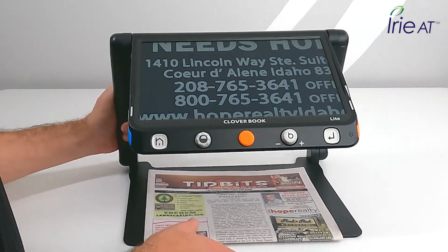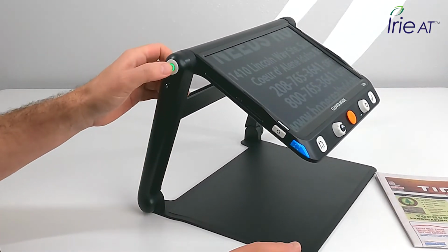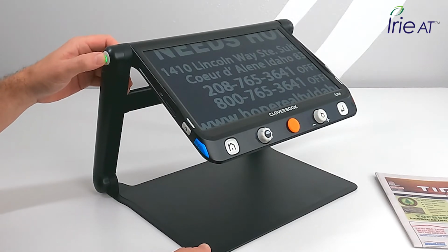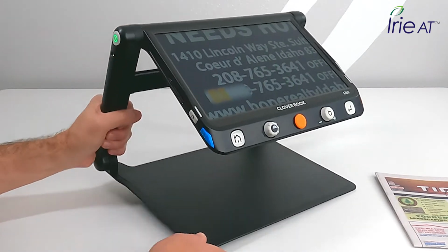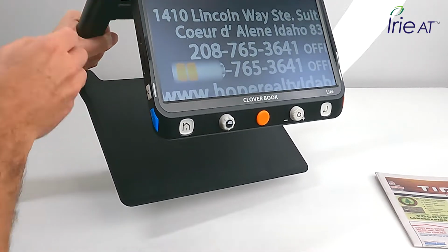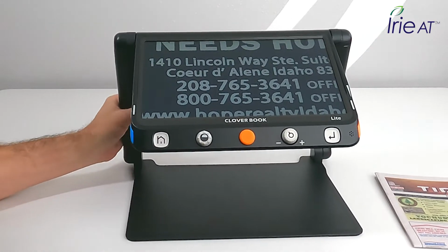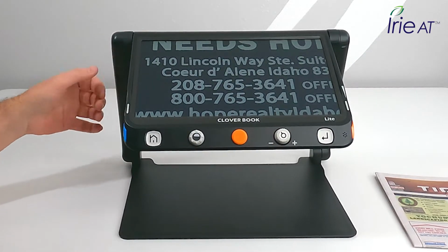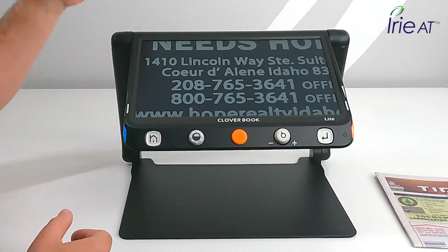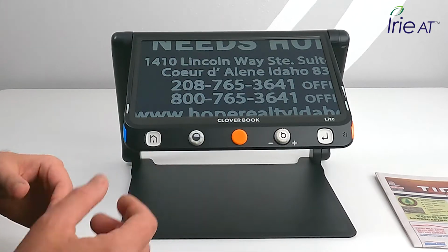All right, so let's look at some of the other things we got going on here. So the power button, I can also long press it and turn it off. Medium battery. Short press it, and it shows me, I'll do that again, I don't know if you saw that. Medium battery. Gives me an icon on the screen, shows me the battery level. Looks like I need to be charging this guy pretty soon. But just give a short press on the power button to do that. Do a long press and it'll give you an option for sleep or turn off. And you just tap one of those and it'll do that.